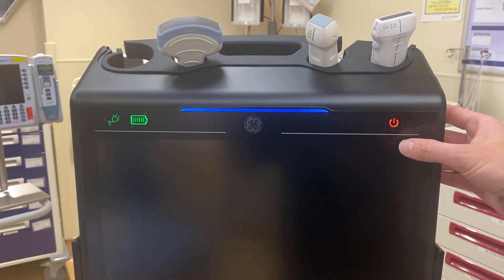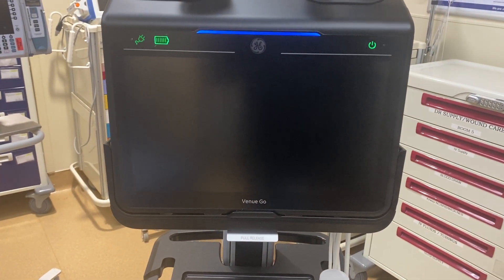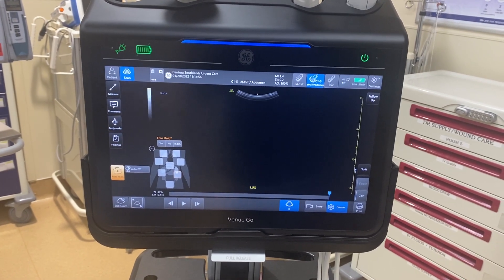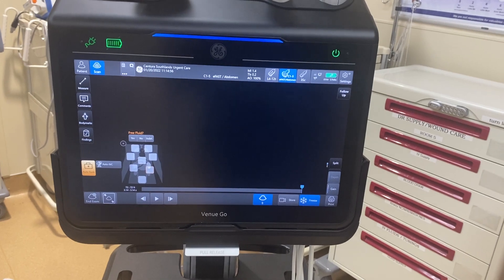The power button is on the top right. We're just gonna push it to start it up. On the top left, you can see the power indicator giving you your battery indicator, how much juice you have left and if it's plugged in.